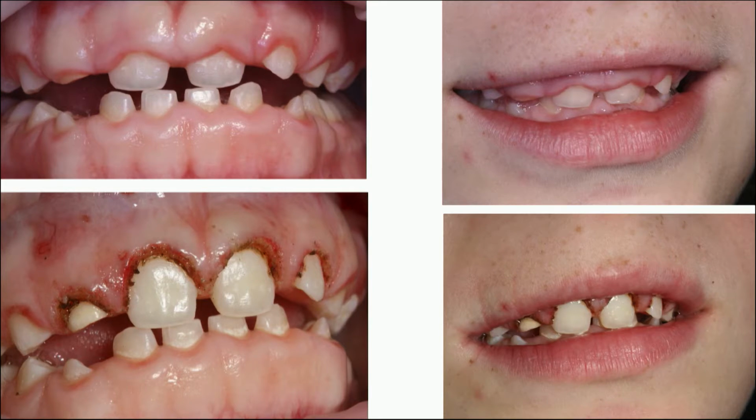And how long would those tissues take to resemble more normal looking tissues in that case? In a case like this, we would tell the patient it's going to look a little bit brown for about 2 or 3 days. By the 4th day, it will start to be pink, and on the 5th day, you'll be able to start brushing it. So is that essentially the same instructions or warnings you would give a patient for pretty much any time you've used the laser? Almost exactly the same. There's very, very few times we would ever vary that advice. It's almost like a standard sort of advice that I would have used over 30 years.